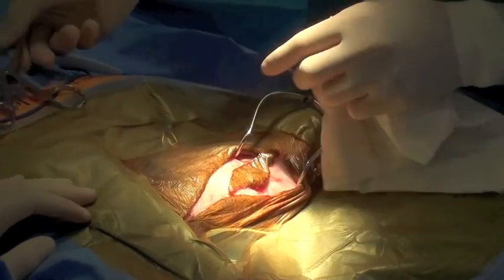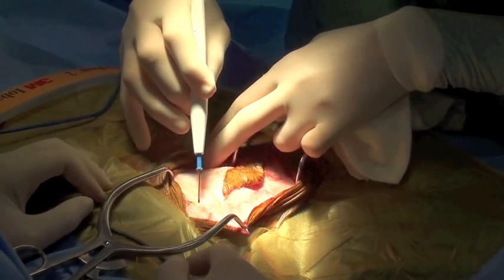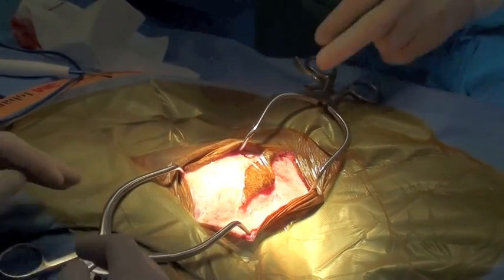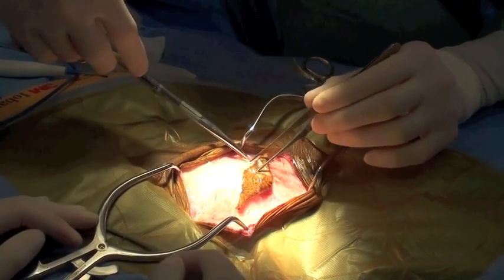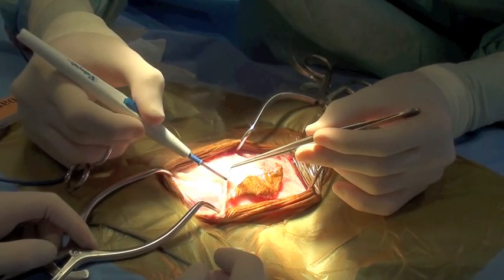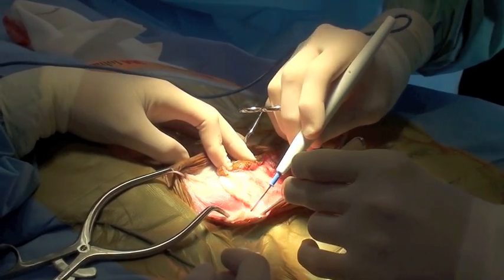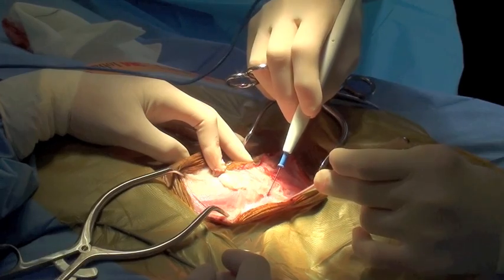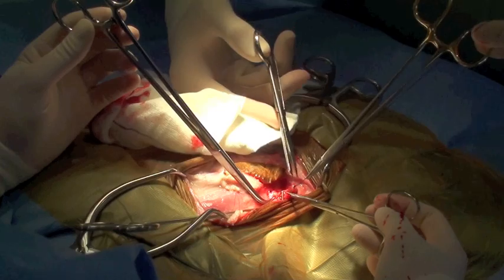Gelpi retractors are used to improve visualization. The superficial pectoral muscle is dissected free from the proximal humerus to increase exposure to the medial compartment of the axilla. This is performed in order to allow placement of lead sheeting to protect the rest of the soft tissues from the radiation therapy.